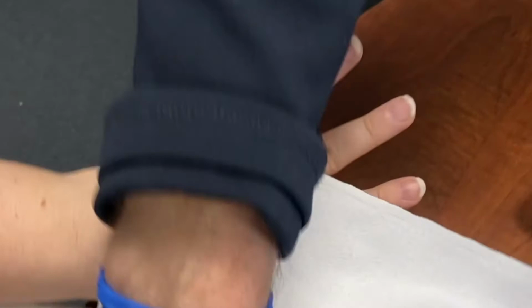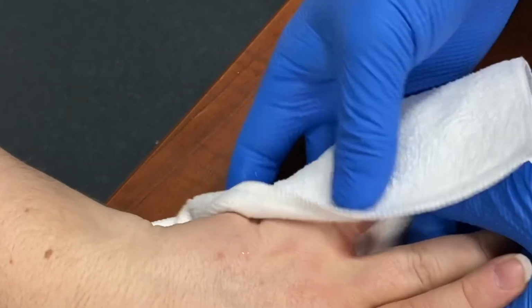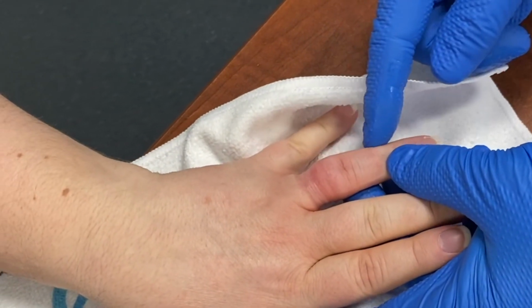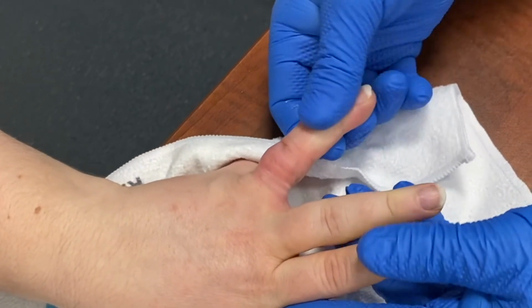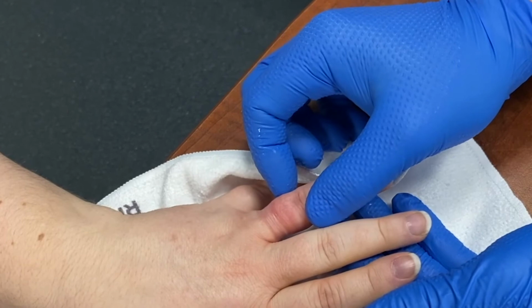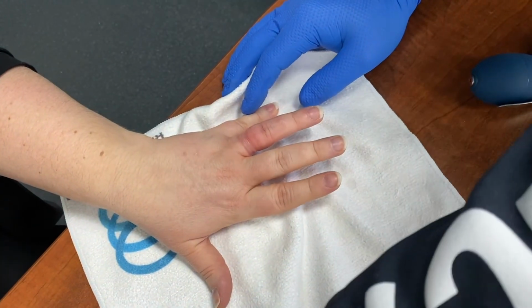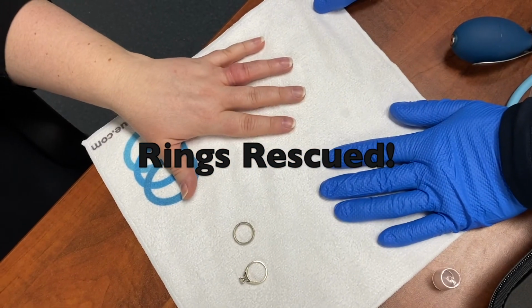There we go. Done. So you can wipe this off here. And so what happens is it always gets a little tight through here, but the ring came off. There's no abrasions. There's no skin damage there. The finger's obviously skinnier than when we started. It'll go right back to the size it was before. The good news is that both those rings came off and the problem is solved.